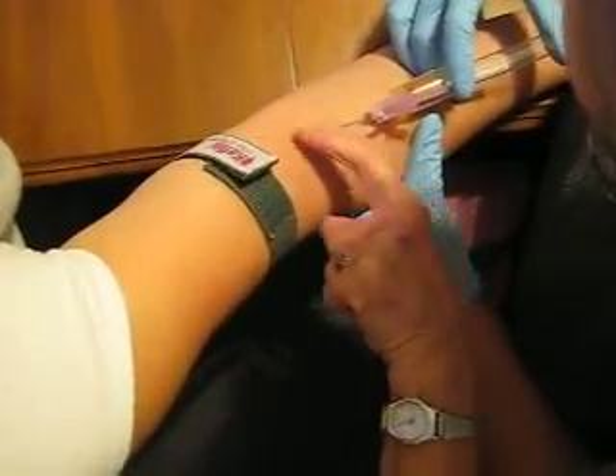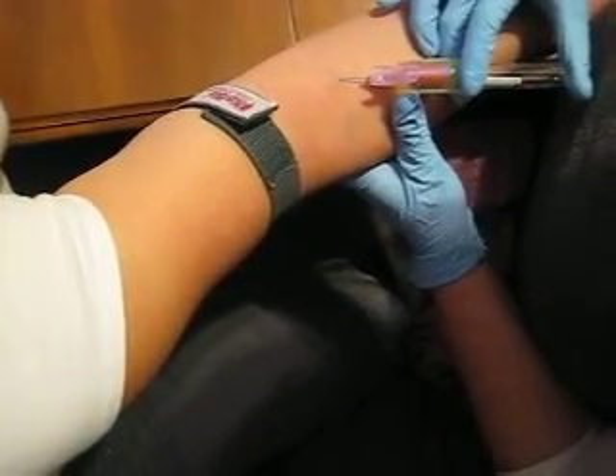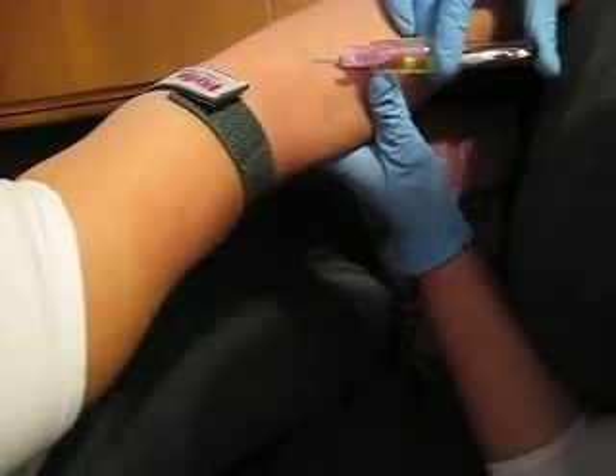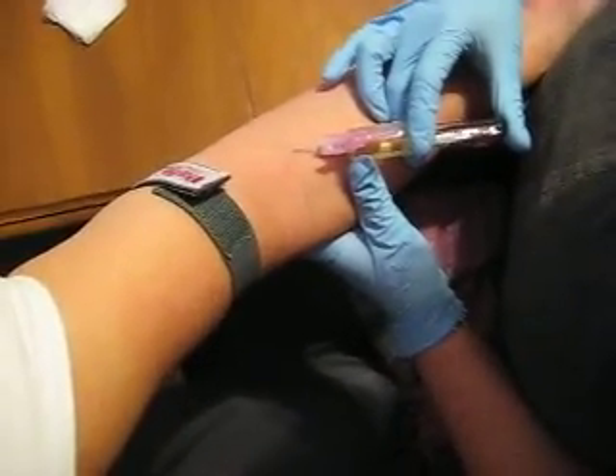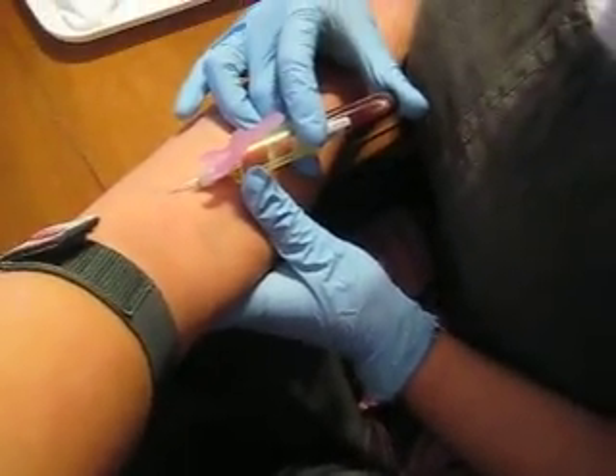Okay, I'm going to get it right this time. That's right. Now you notice that the vein goes that way. Yeah. There you go — you want to be — there you go. Push that. Yeah, bingo! Yay! Nice.